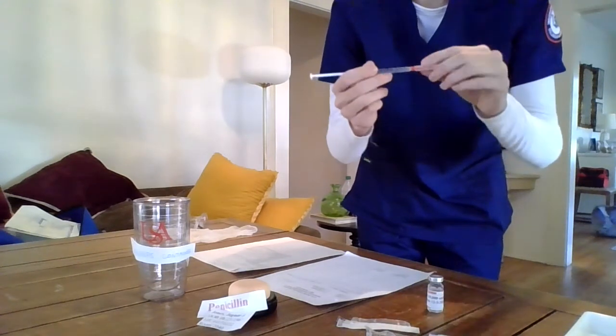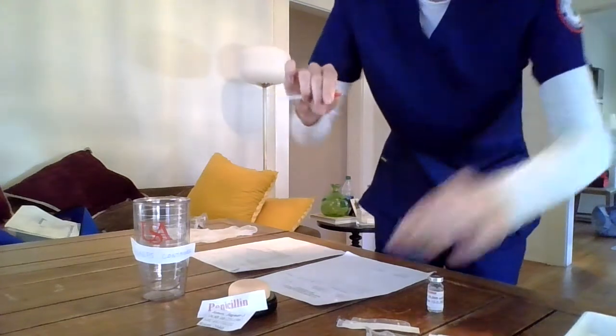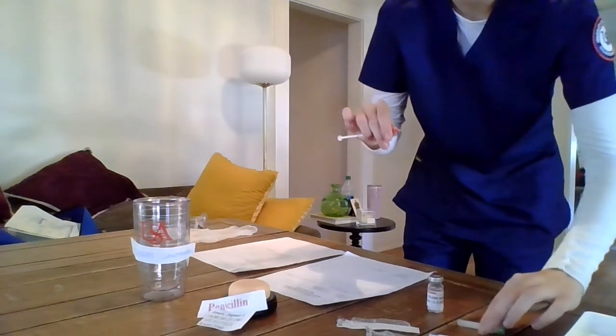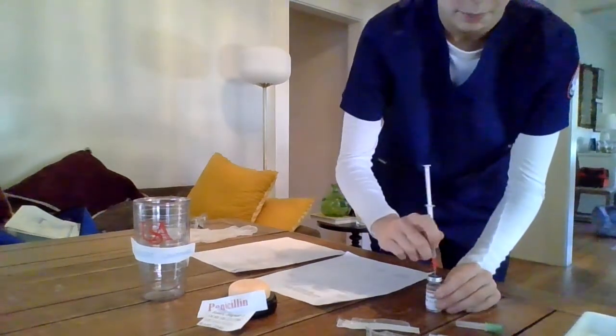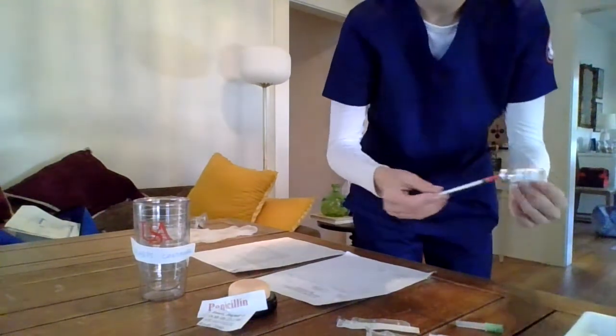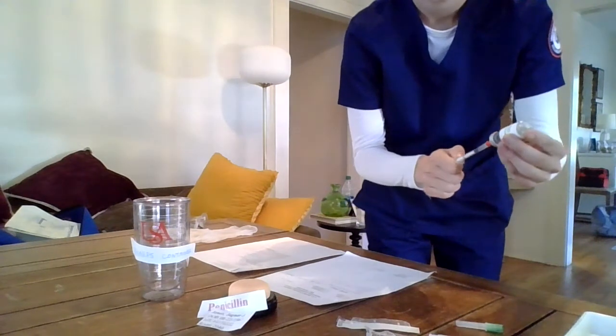Then I'm going to remove this cap and place it down. And now that my vial has had time to dry, I will insert my air and then withdraw half a milliliter of heparin.